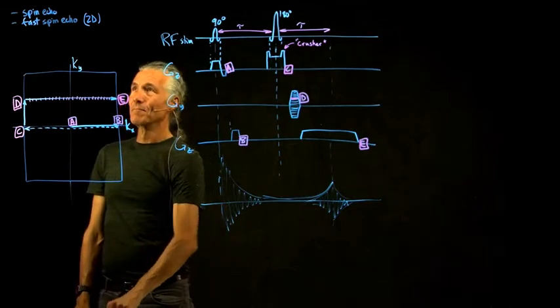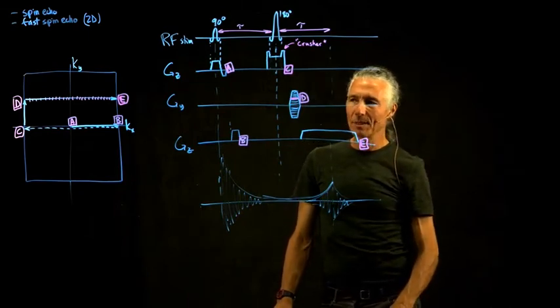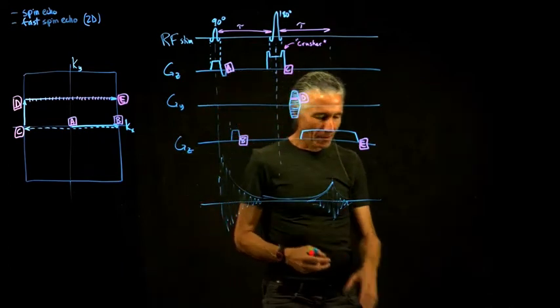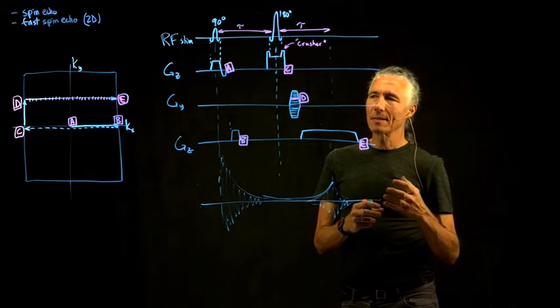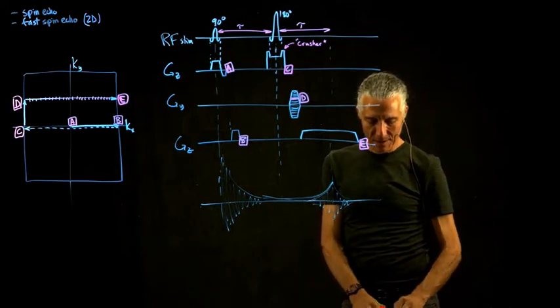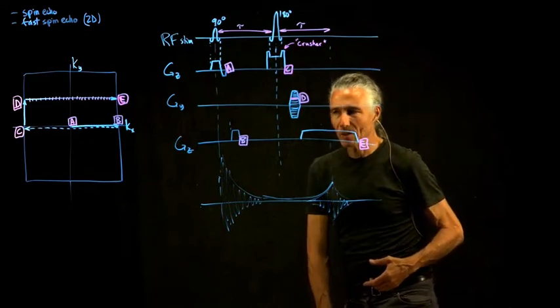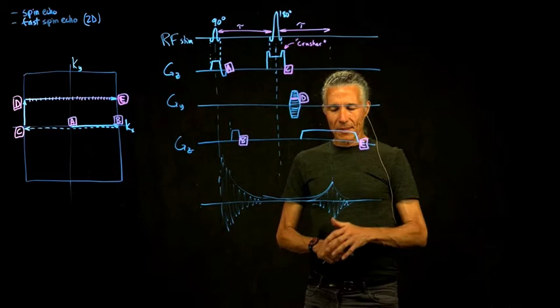So what's slow about it? The problem is, say you wanted to get a T2 weighted scan. T2 weighted scans are very common because they can be used to detect a tumor, which will often have a signature of very bright contrast in a T2 weighted scan. The realization of this is essentially what drove all the technology to make MRI, in order to be able to detect brain tumors, because you could see the strong contrast between a brain tumor and the surrounding tissue. And so that means you need a good T2 weighted scan.